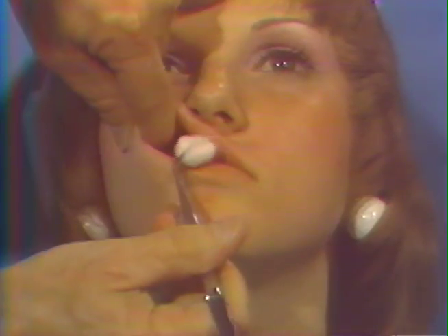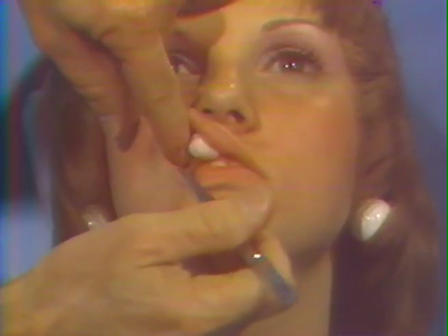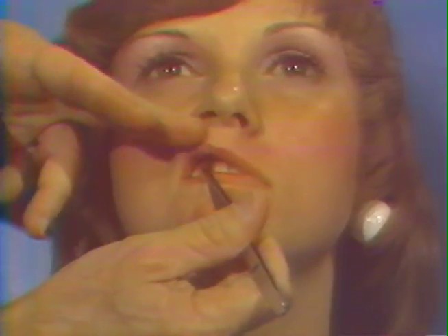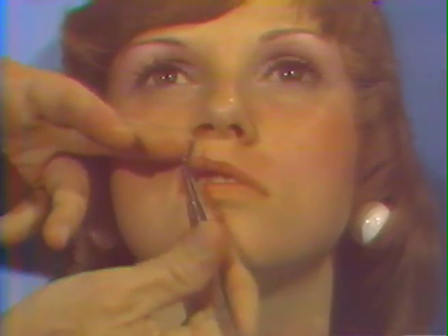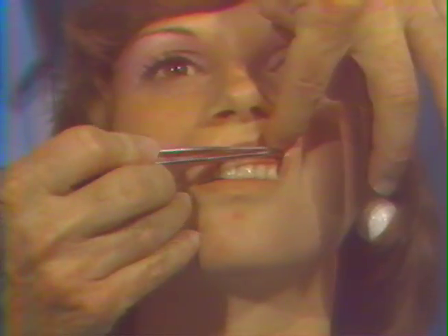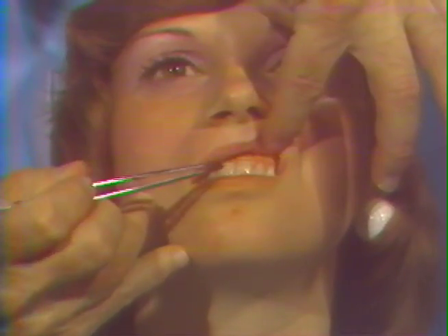Let me lift it up. Place the cotton roll to the opposite side of the midline. This will now produce topical anesthesia to this side so that the needle may be placed in this point and passed horizontally to infiltrate the tissue of the left side. Now open again.